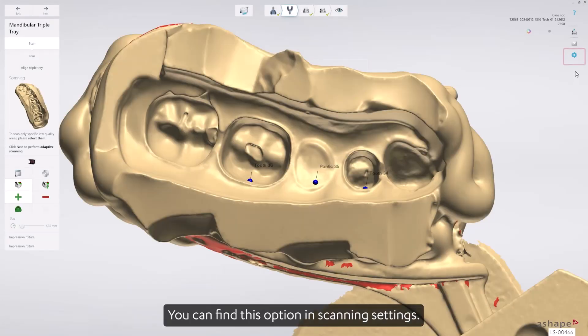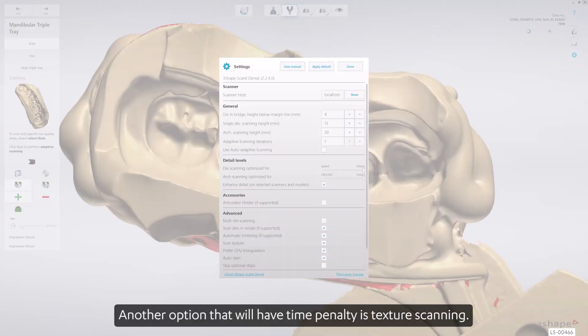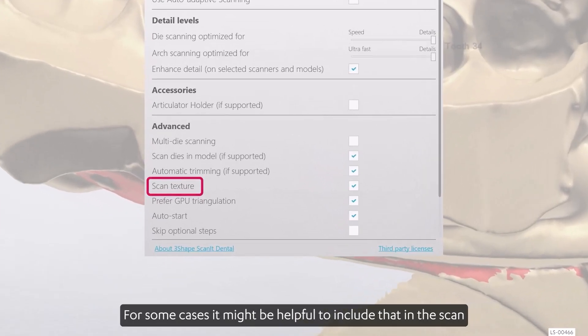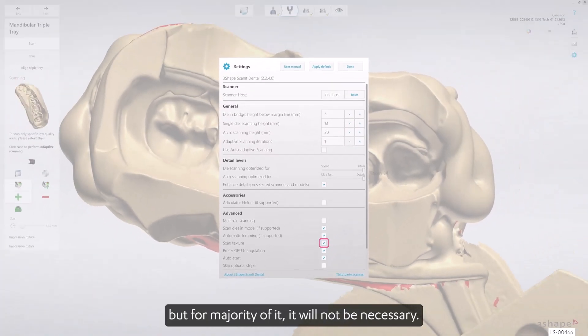You can find this option in scanning settings. Another option that will have a time penalty is texture scanning. For some cases it might be helpful to include that in the scan, but for the majority it will not be necessary.